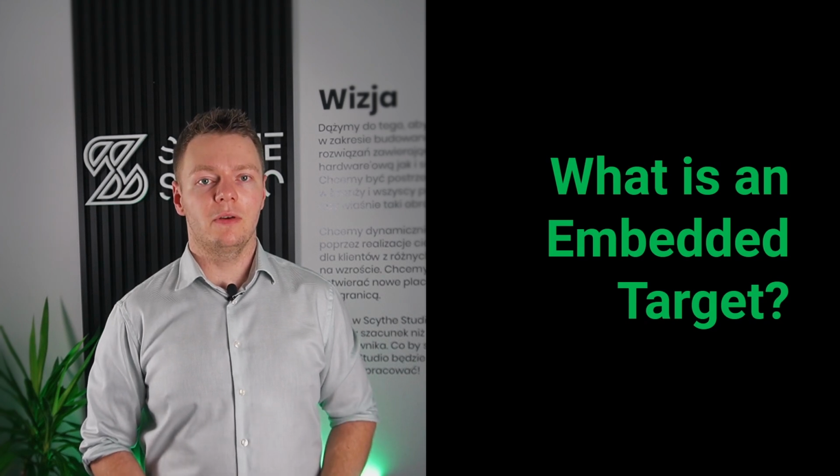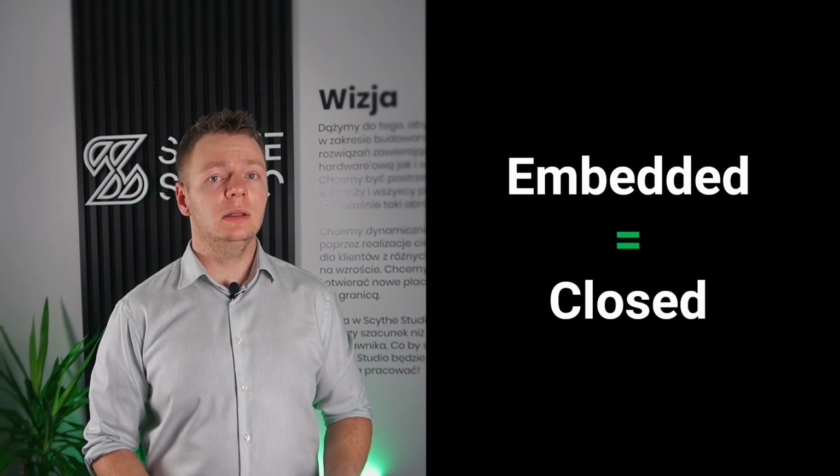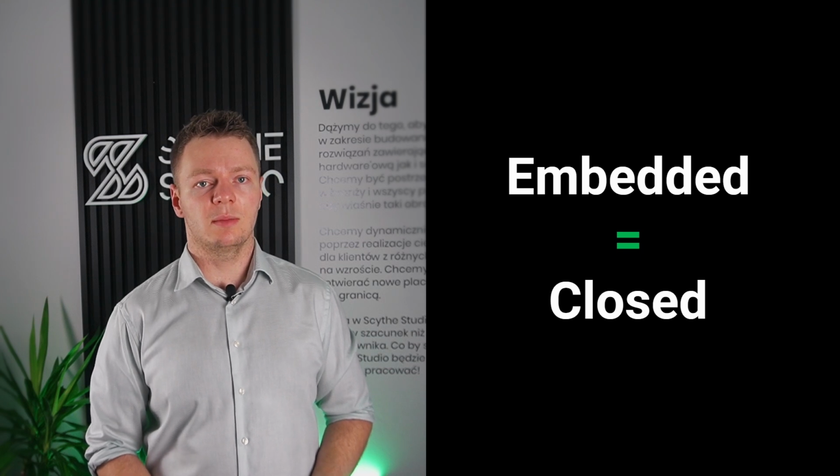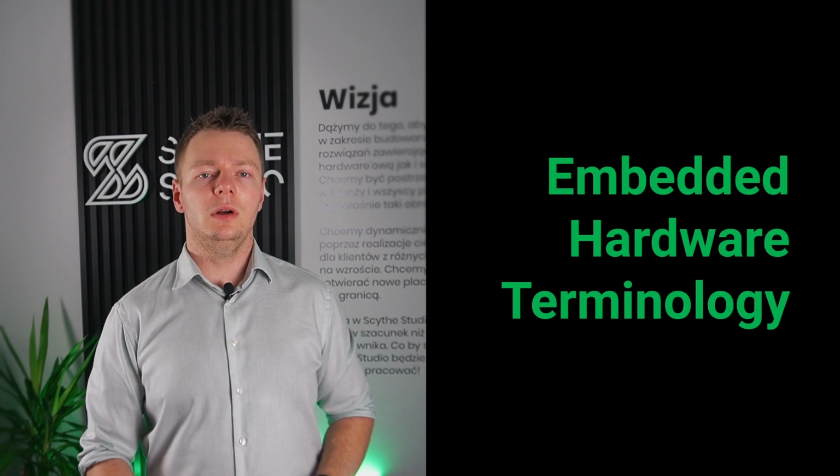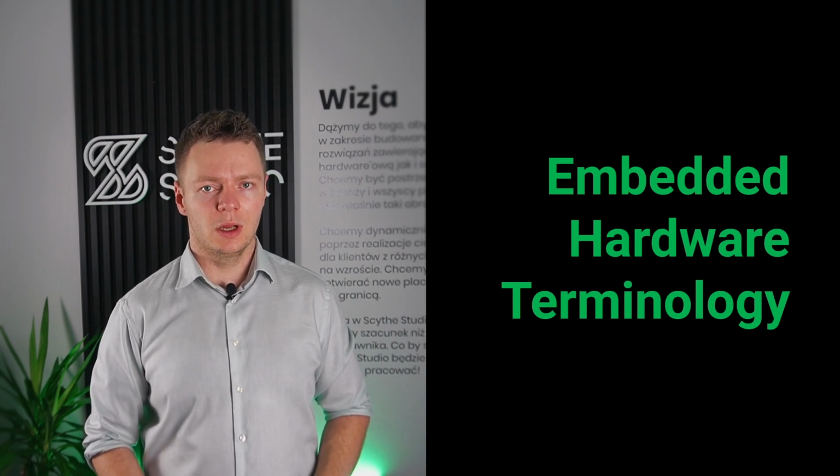Before we proceed, let's clarify what we mean by embedded target. An embedded target refers to the actual hardware platform that will run the software of your medical device. This can range from simple microcontrollers to more powerful microprocessors. Your choice of hardware will dictate what kind of software you can deploy, including which features, interfaces, and user experiences are feasible. Medical devices can actually also run on regular PCs, so it's tough to say what embedded device actually means. The best explanation that I have heard so far is that embedded means closed. So embedded devices are systems that you cannot really interfere with. You have to know what is what in terms of hardware. The boundaries when it comes to individual terms are increasingly blurred. Let's give it a try anyway.